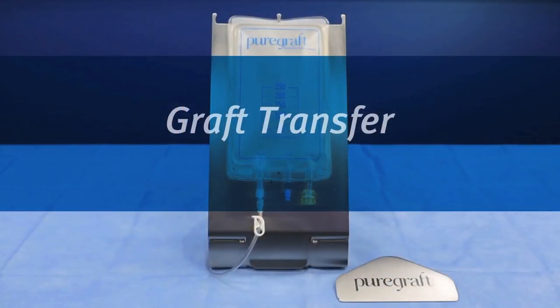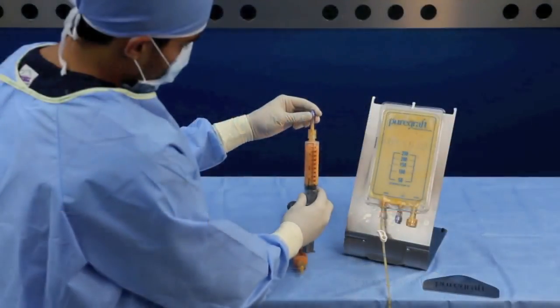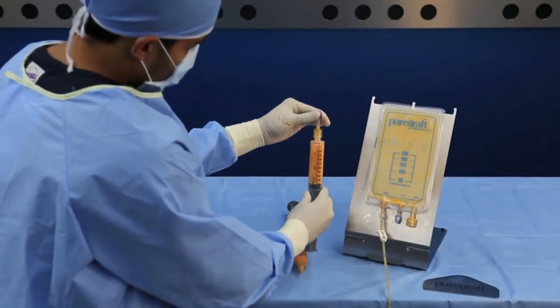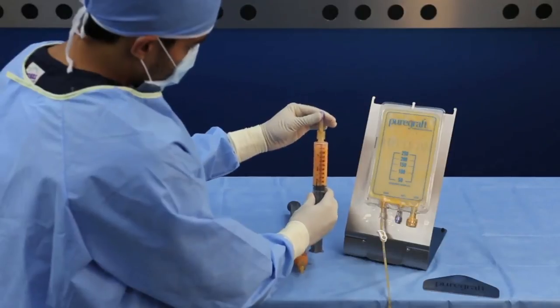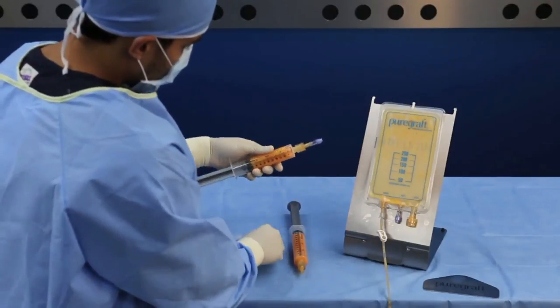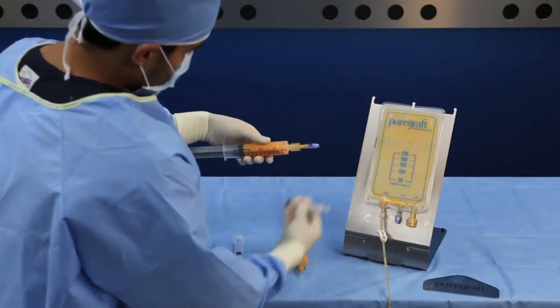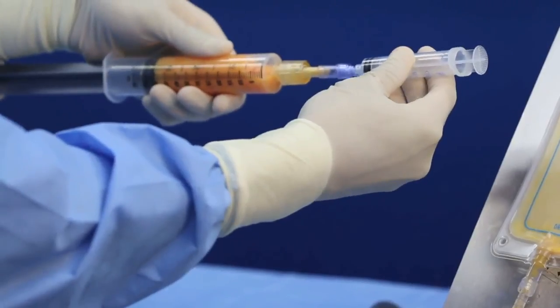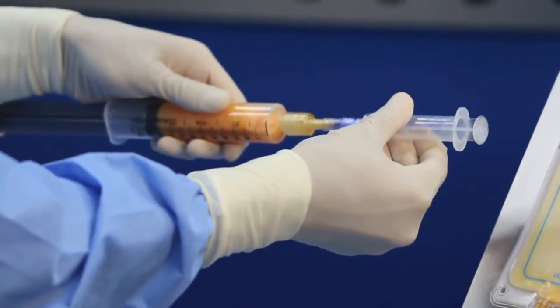The extracted graft can be transferred from a Toomey to a luer lock syringe using the supplied tapper to luer lock adapter. First, attach the adapter to the tapper end of the Toomey syringe, then attach a luer lock syringe on the blue end of the adapter.